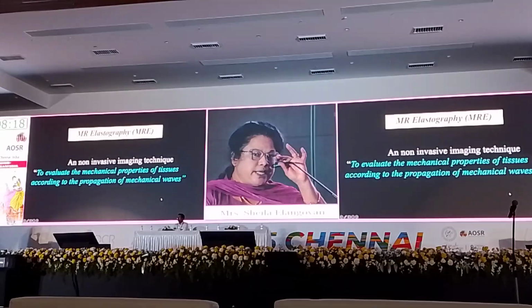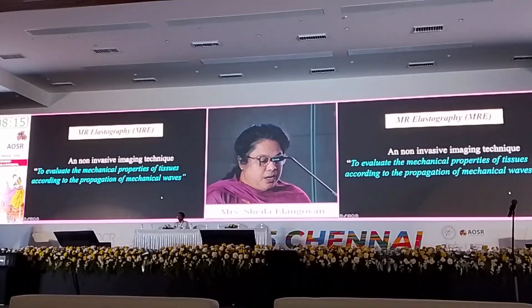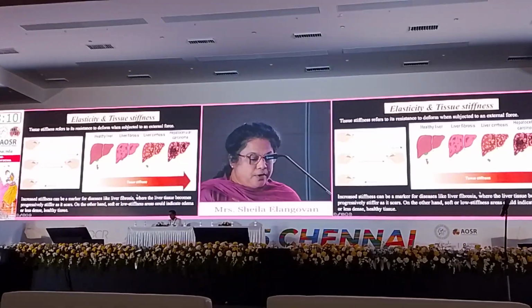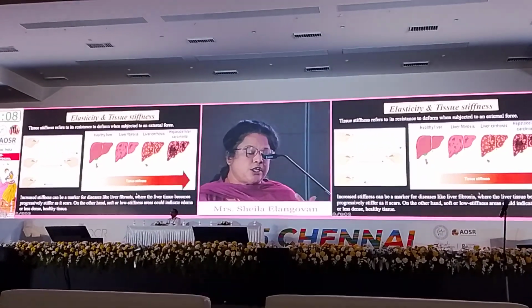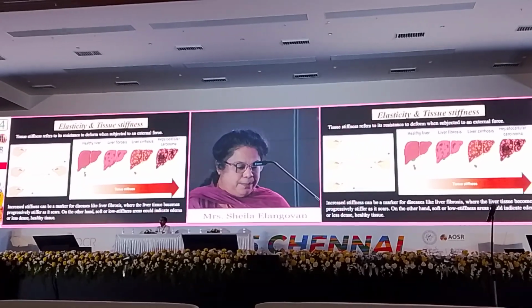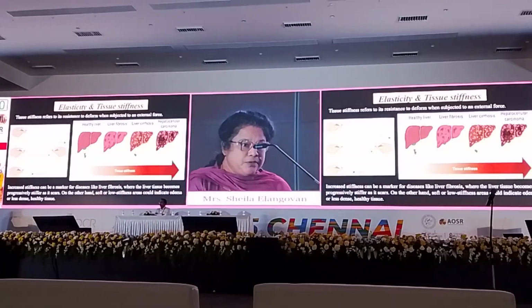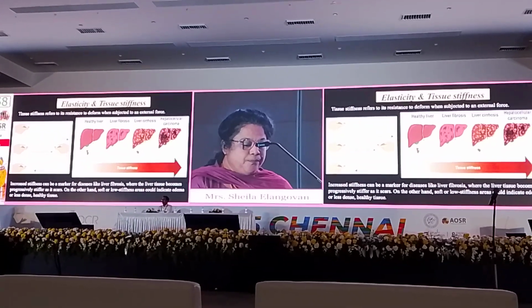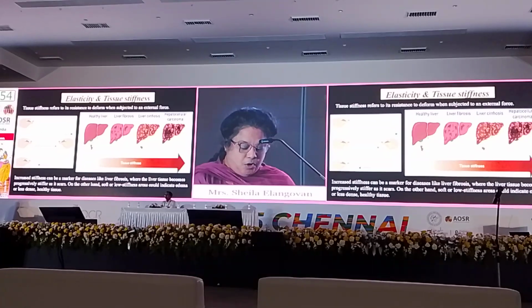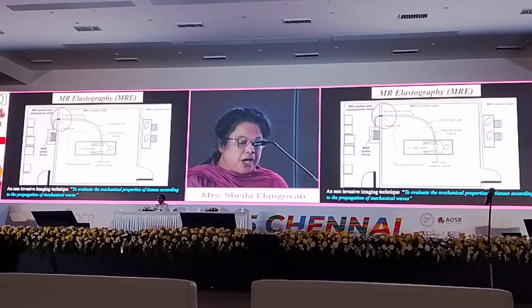Moving on to the next technique, MR elastography, to evaluate the mechanical properties of tissue. So what is elasticity? The ability of a material to retain its original shape after it is being put into pressure, stretched or compressed. So we are going to evaluate the tissue stiffness here. Okay, for liver, in a healthy tissue and in a lesion or in pathologies, the stiffness increases. Okay, so this grading becomes really important to pick up pathologies.